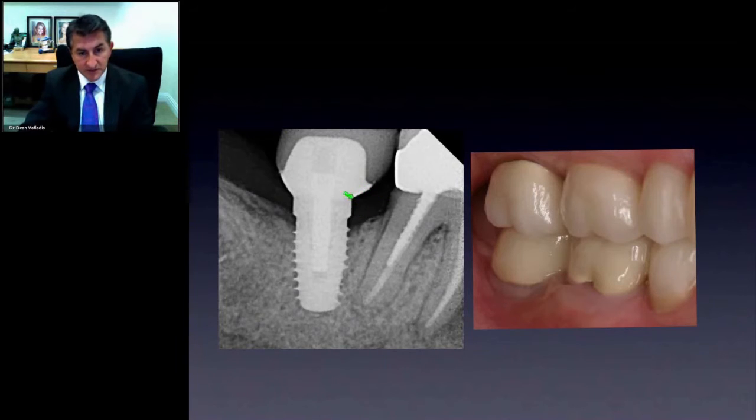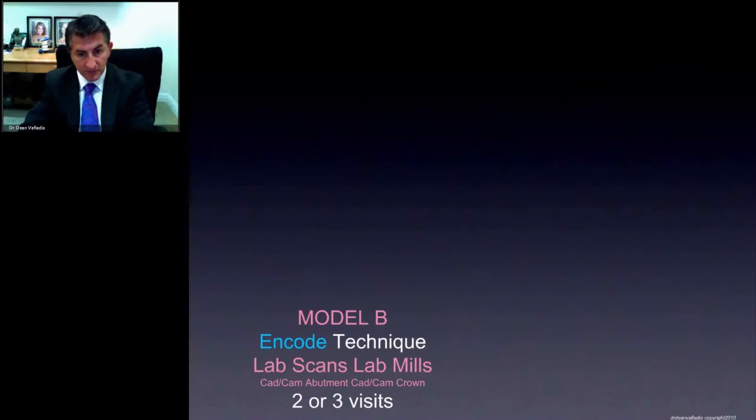Here we're going to minimize the tissue. You can't see the tissue, but it's actually right here. It ends right at the line level, and it ends right here. And that triangle is really small, like a natural tooth. All this is filled in with soft tissue, which is all right there. That's a big thing in terms of the designing of the abutments.